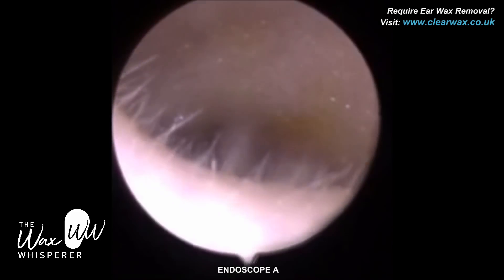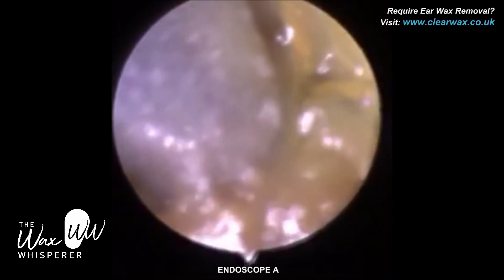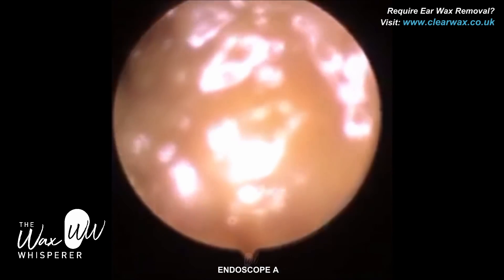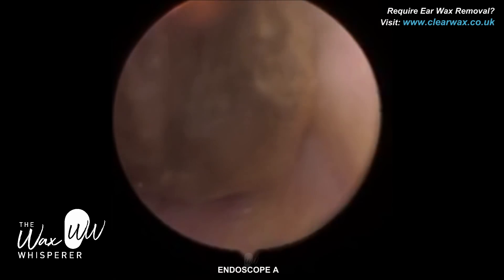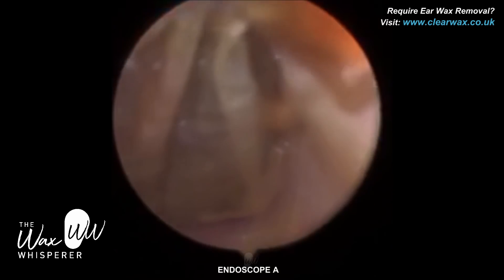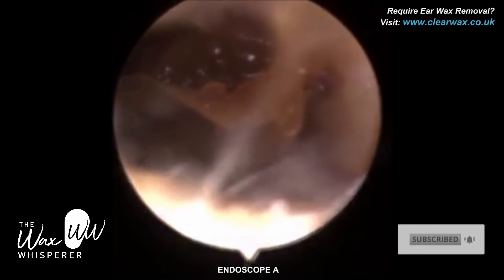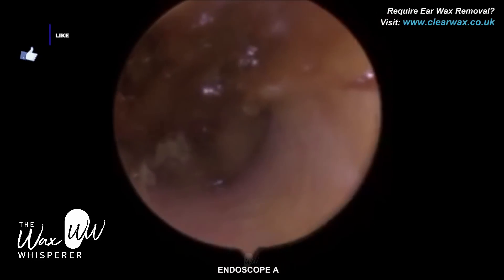It's a very interesting video. I've actually performed the procedure using two different endoscopes. This is Endoscope A, and at the end I've got images of both endoscopes side by side. Endoscope A is an endoscope that I, during my research and development of developing the iClearScope, purchased from China around six years ago.